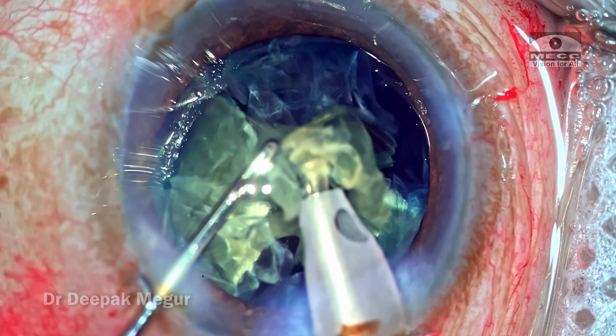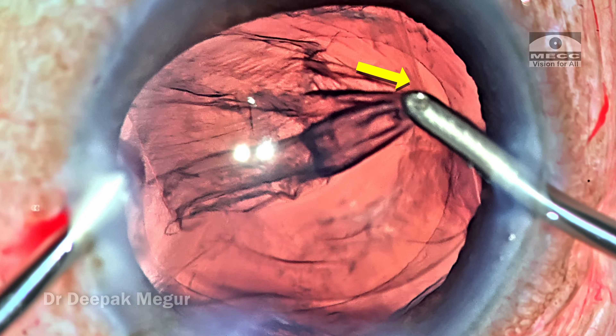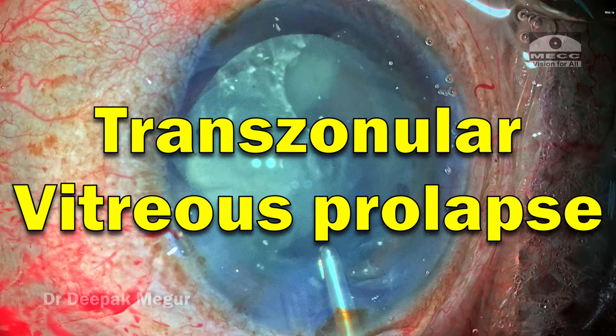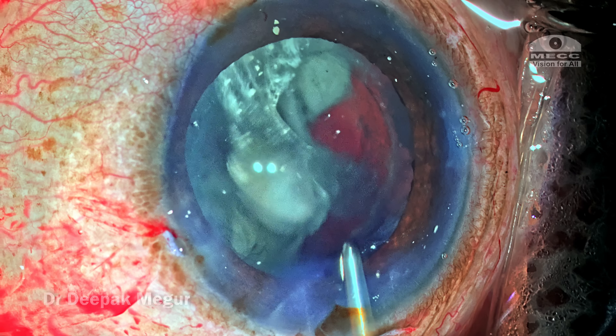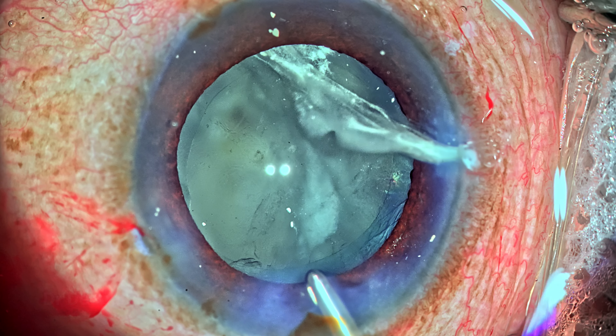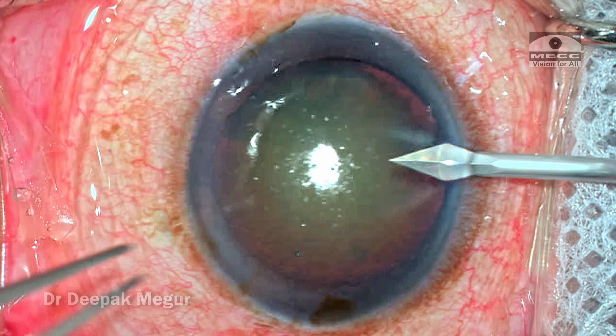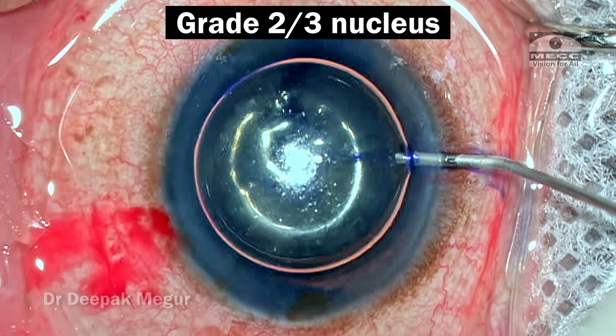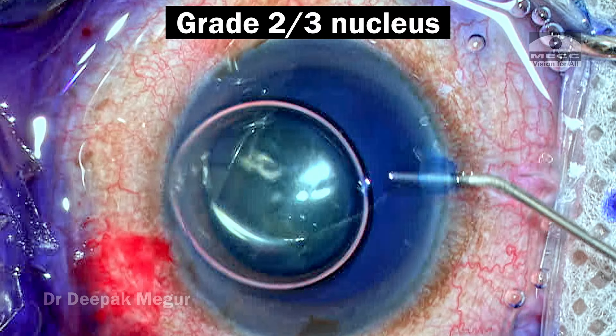Today I'll be taking you through a case where I had an intraoperative trans-zonular vitreous prolapse which I was not anticipating at the beginning of the surgery. So I begin the surgery — this is a seemingly innocuous looking case: a 65-year-old gentleman with a grade 2 to grade 3 nucleus.